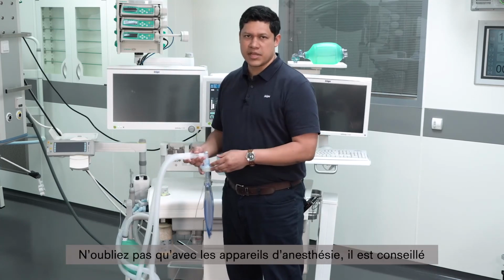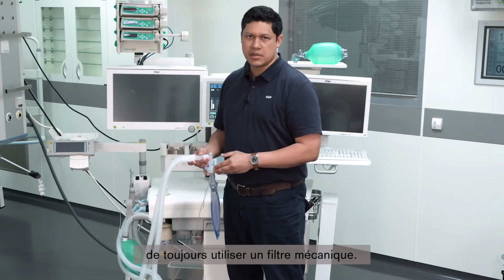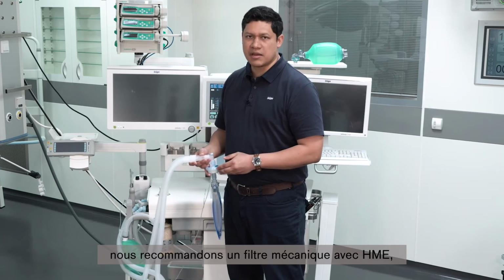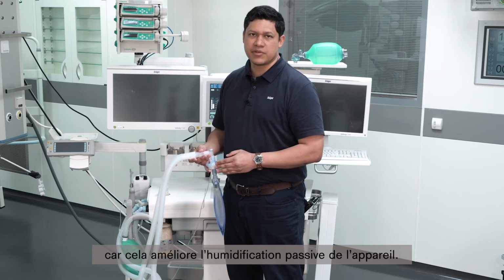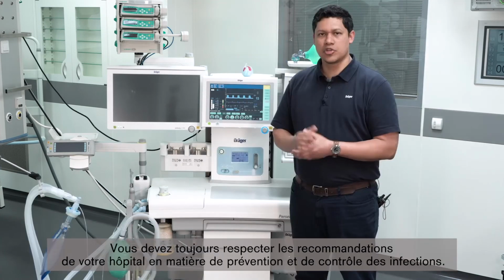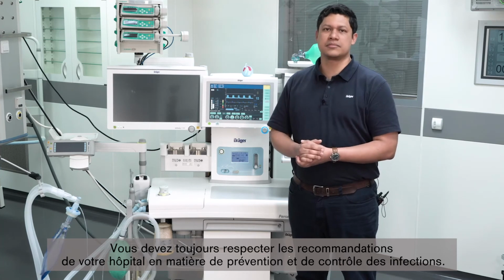Keep in mind the recommendation when using an anesthesia device is always to use a mechanical filter. When using the device for long-term ventilation, you should use a mechanical filter with HME. That is to improve the passive humidification of the system, and place the filter on the system the closest possible to the patient. Hospital guidelines for infection prevention and control should always be followed.